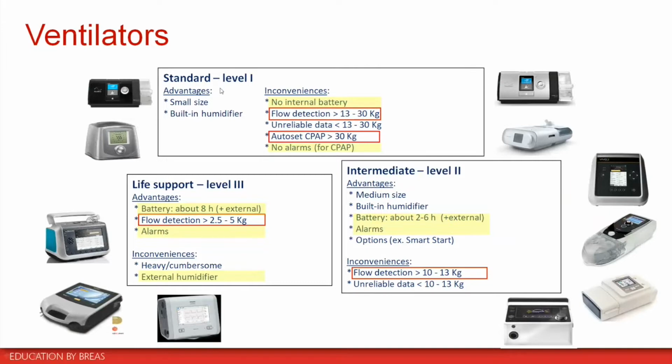The advantages of these level 1 ventilators are that they are small. Many of them can do only CPAP ventilation, and some of them CPAP or NIV.